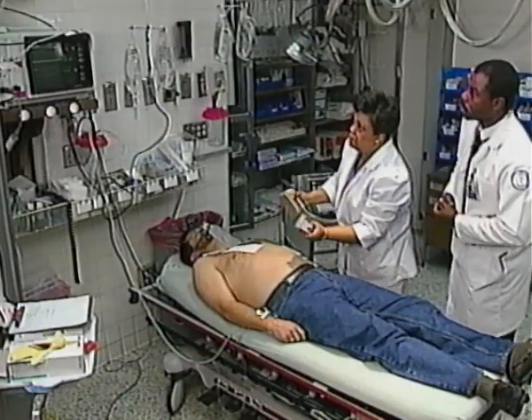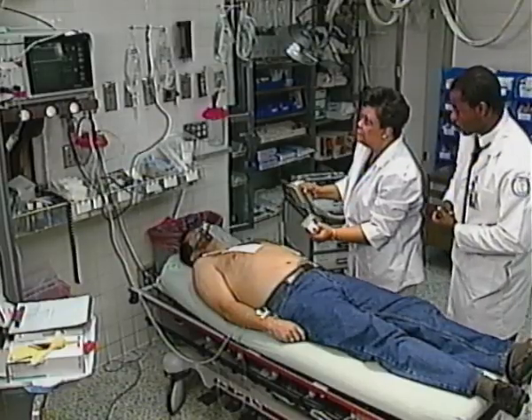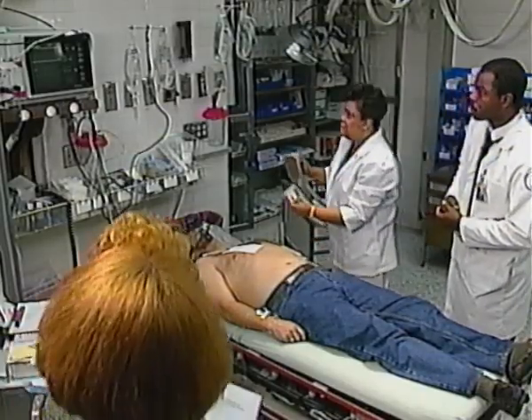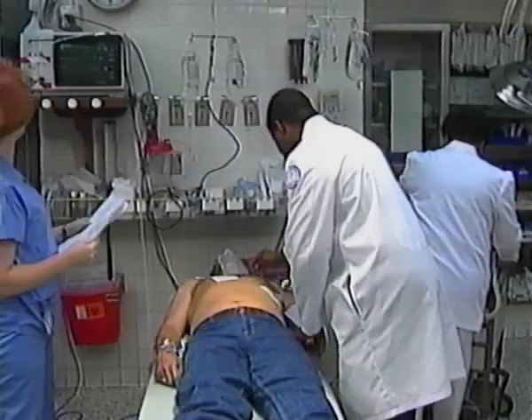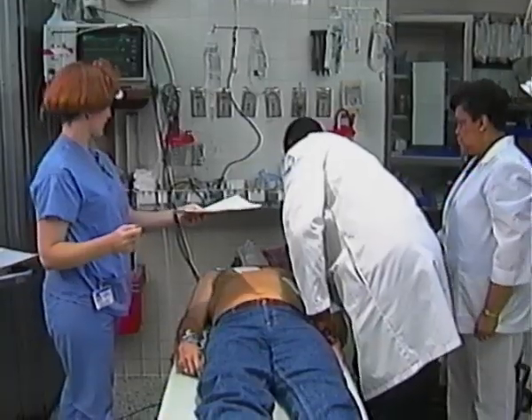He's converted to a normal sinus rhythm, with a pulse of about 99. But I'm getting a lot of PVCs. Oh, his pulse ox is 98% now. And here are these labs if you want to take a look at those. Oh, thanks.